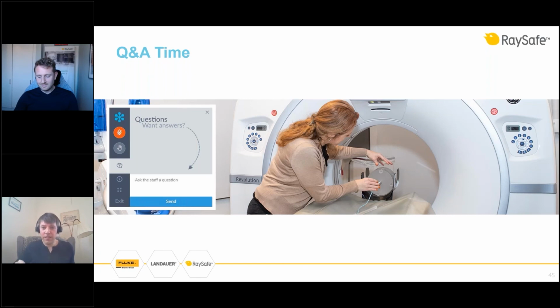that when you do acceptance testing, and also after you have changed tube or any other major change on the scanner, then you should measure CTDI in a phantom.